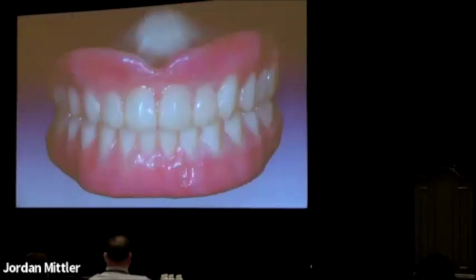And this is a completely milled denture. It's milled out of a single block of acrylic, and then the pink is just pink stain and coloring that we added onto it for aesthetics. And this is a quick and easy way to do this. This could be 3D printed or milled, actually. There was some discussion about the two technologies. It can be done either way. This particular one was 3D printed, but strength was not a super concern at this point.